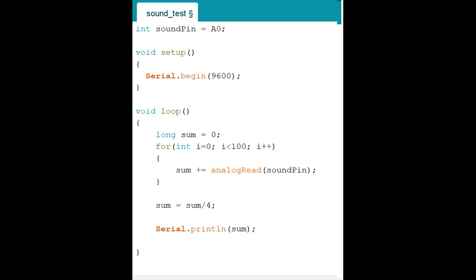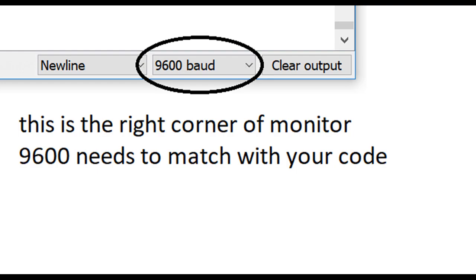So capital letter S, Serial, dot, no space, begin, parenthesis, 9600, close parenthesis and semicolon, and enter and do the braces. So 9600 is, you will see when you play with tools and monitors and things like that, the baud rate. I'm going to tell you at the end, but this has to match with your serial monitor, so that it doesn't have any miscommunication between output and input.